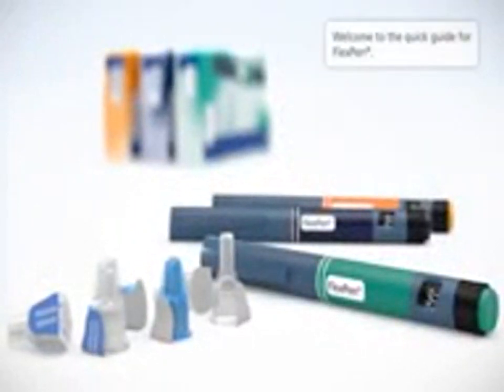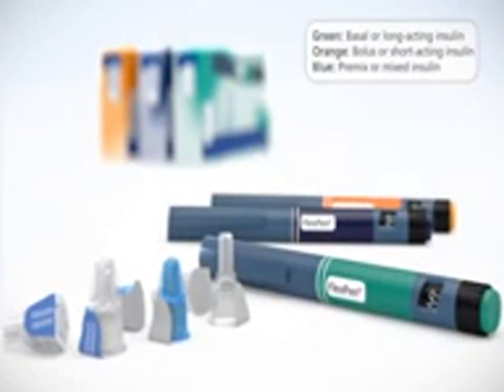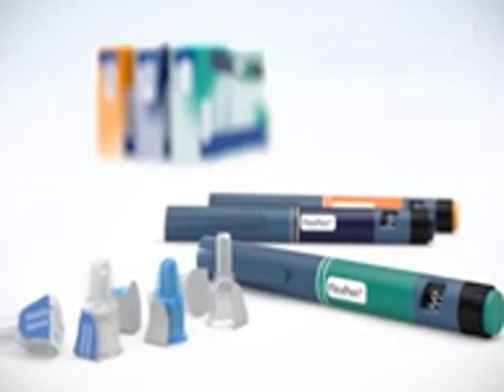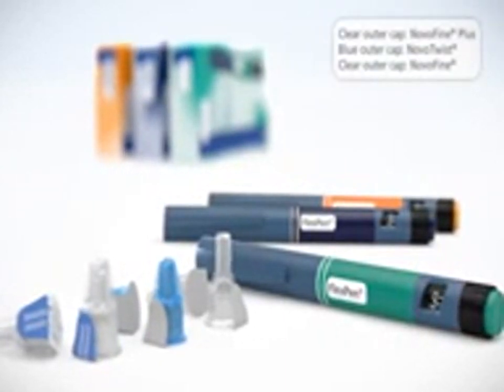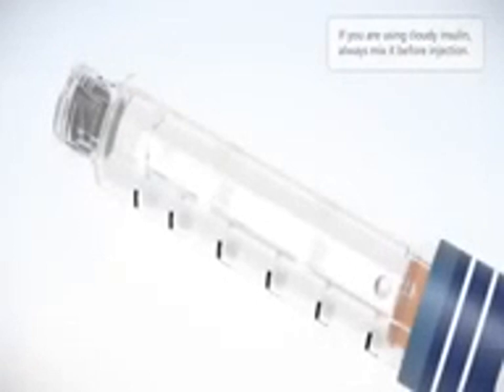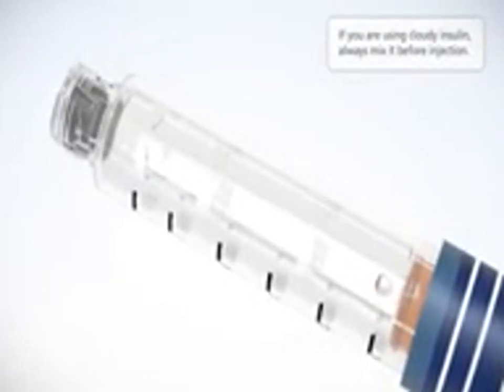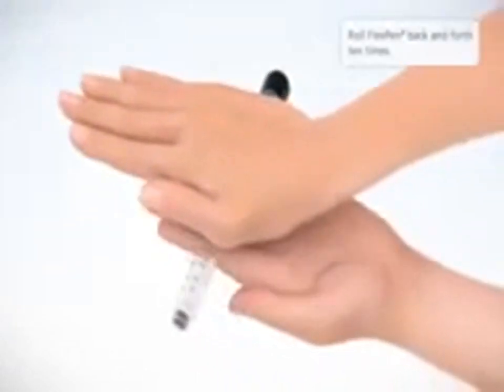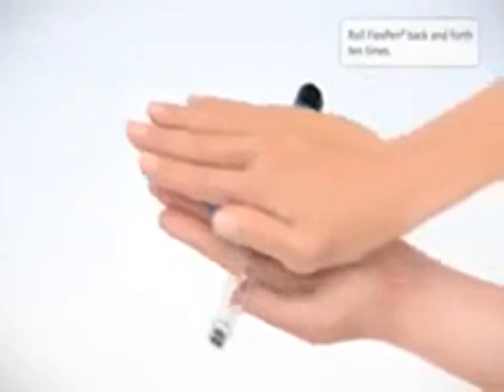Welcome to the quick guide for FlexPen. Start by checking the pen label to be sure that FlexPen contains the type of insulin you need. Then check the needle cap and paper tab to identify which needle you are using. If you're using cloudy insulin, always mix it before injection. Roll FlexPen back and forth 10 times.